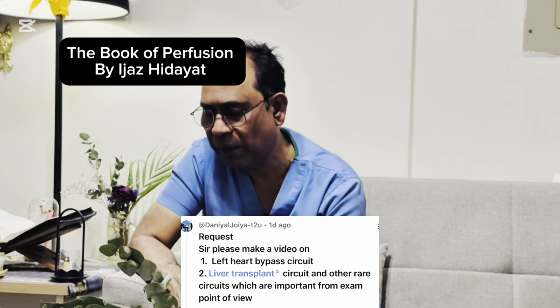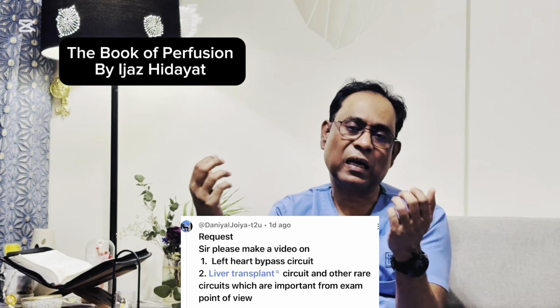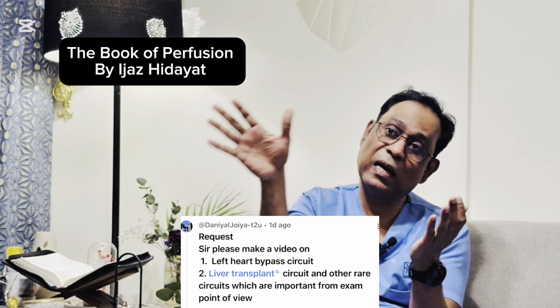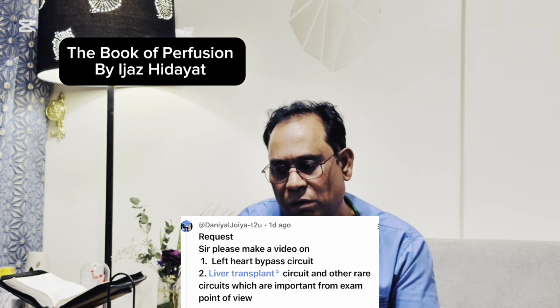Left heart bypass is usually used to repair abdominal or thoracic aortic aneurysms or any abnormalities, and in left heart bypass we never use oxygenators. The oxygenator is eliminated because the lungs are in good shape, so we already get oxygenated blood. Our target is to provide a supply of oxygenated blood to the lower part of the body.